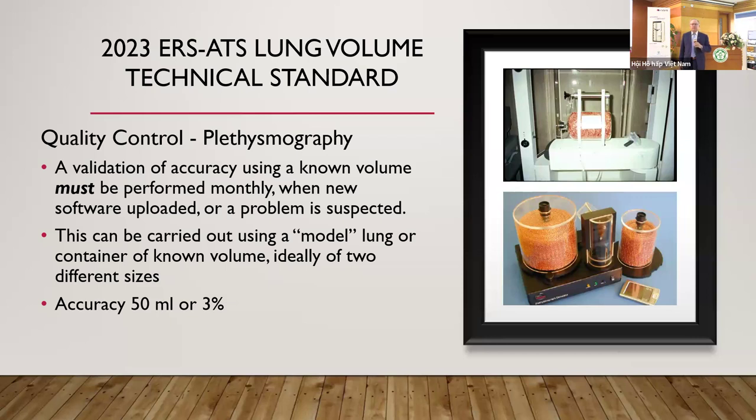mới có. Because nobody was purchasing these, or they weren't incorporated into the purchase of the body box, most manufacturers quit making them. So as the new technical standard is now being rolled out, the manufacturers will have to start making these again so that they're available to you as users. And the intent is, in the future, if you buy a body plethysmograph, it will come with one of these devices. So if you don't have one now, the manufacturers may not even have them available yet, but they will have them available within the next 6 months to a year.